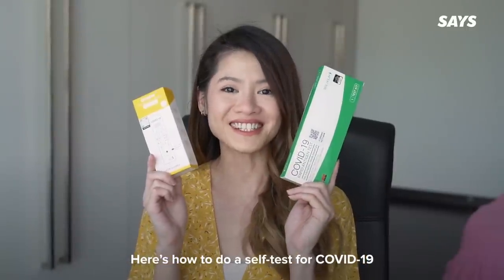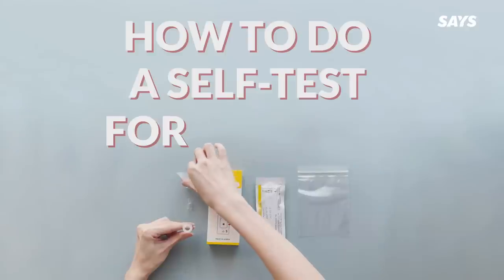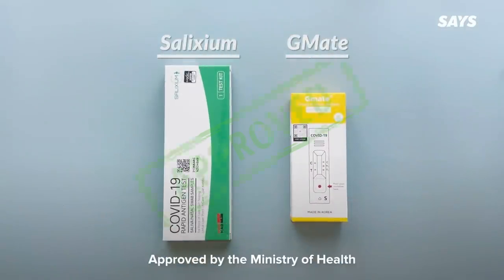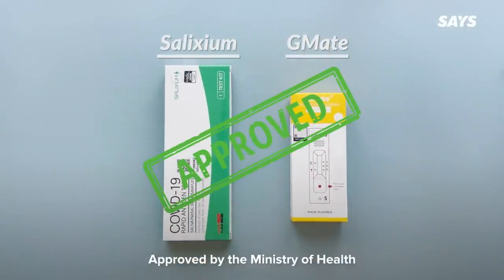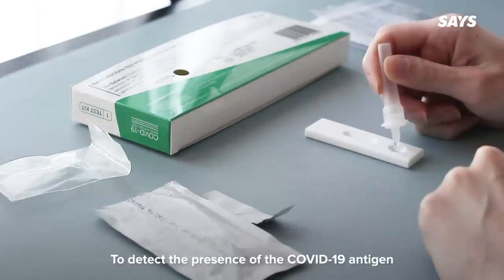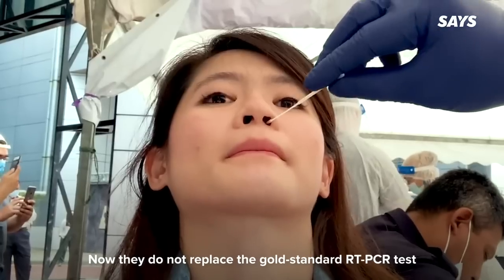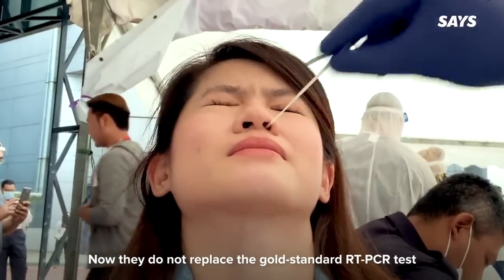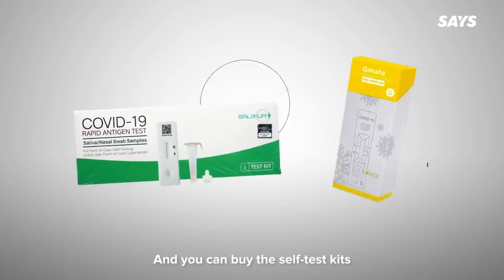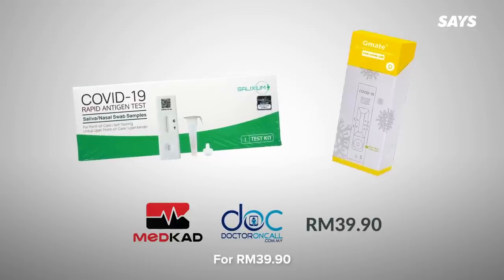Here's how to do a self-test for COVID-19. Here are two COVID-19 self-test kits approved by the Ministry of Health. These are antigen rapid test kits, which are considered screening tests to detect the presence of the COVID-19 antigen. They do not replace the gold standard RT-PCR test that confirms your COVID-19 status. You can buy the self-test kits from authorized pharmacies or online for 39.90 ringgit.